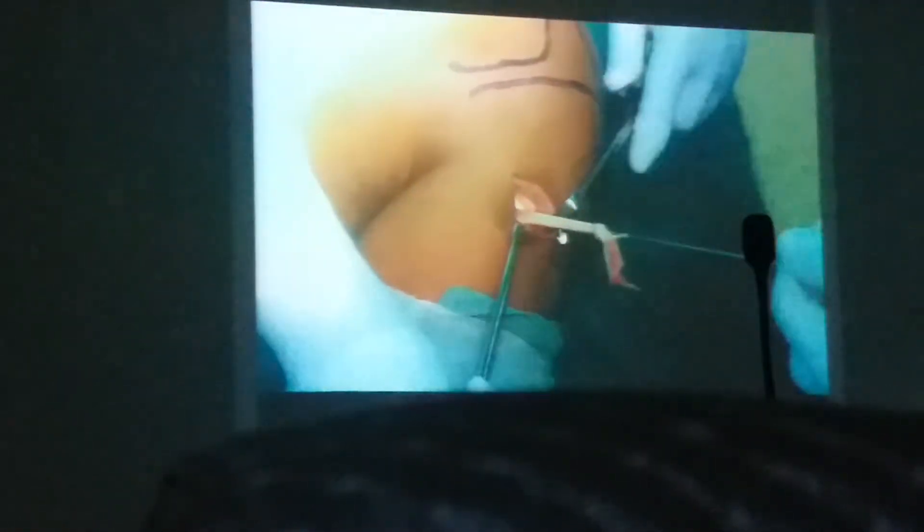In this case, we give a smart tug with the tendon to tear it off. Sometimes when you tear it off, it takes a bit of periosteal sleeve along with the tendon, which helps in later healing of the tendon into the bone tunnels.